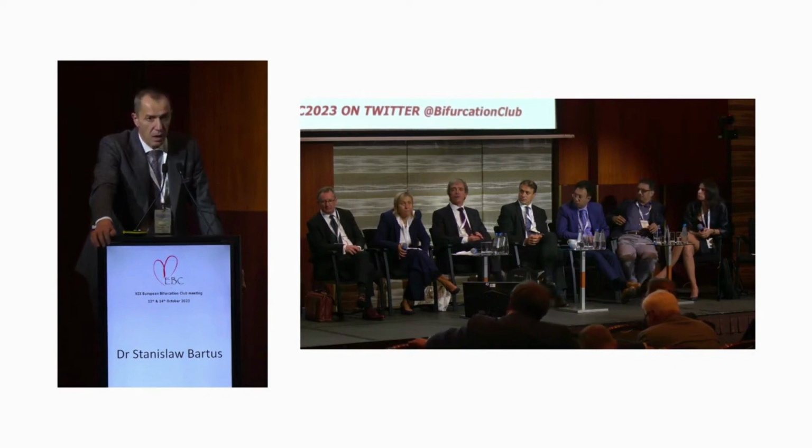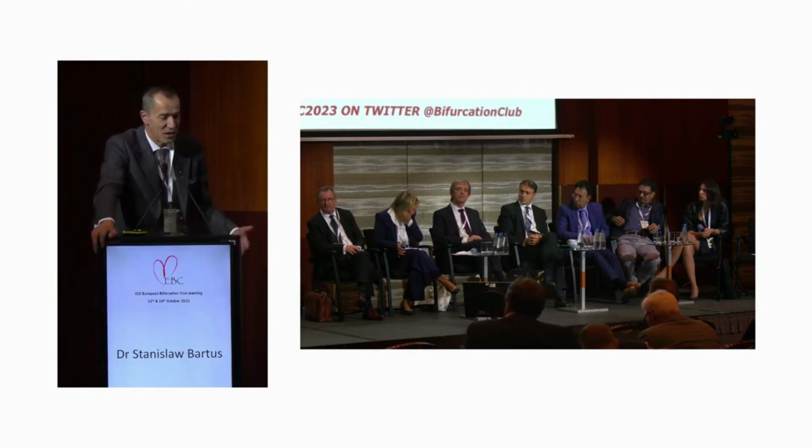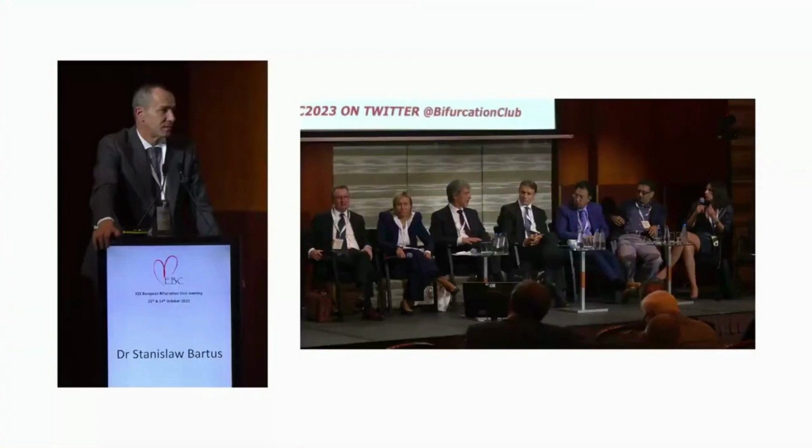And there is no slide because the intention was to be short. However, in OCT, the ostium of the diagonal branch was widely open. But unfortunately, after stenting, I was not able to rewire it again. Of course, I agree with the technique, everything, but just the DPR from the diagonal, in my humble opinion, was unnecessary. That was just my point.